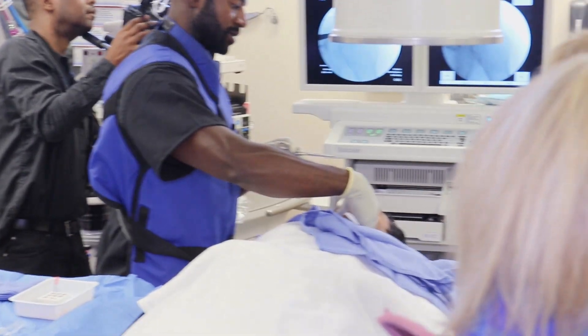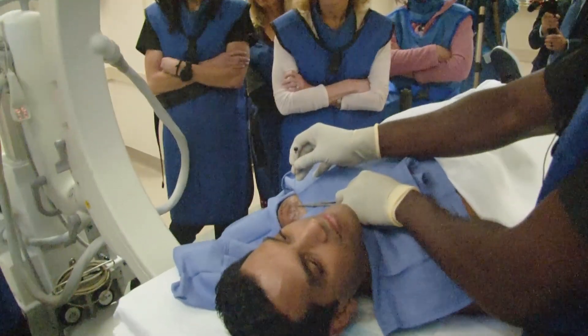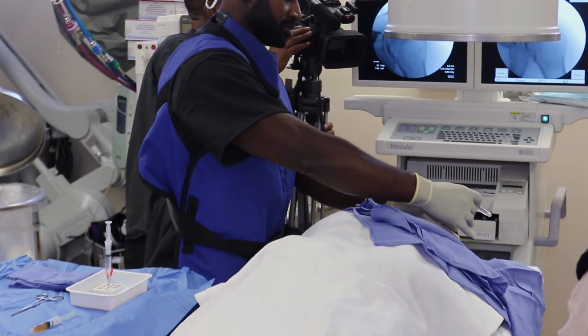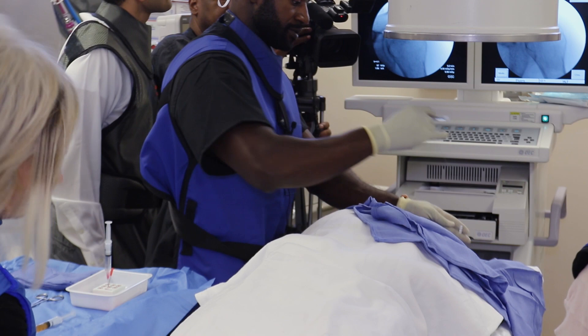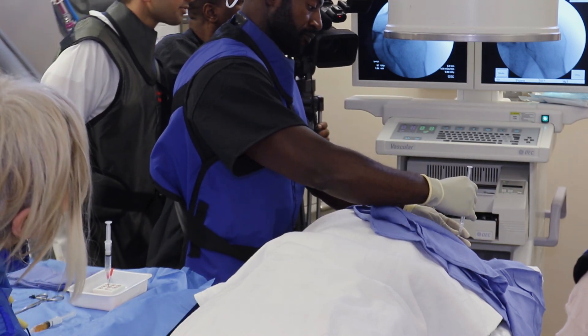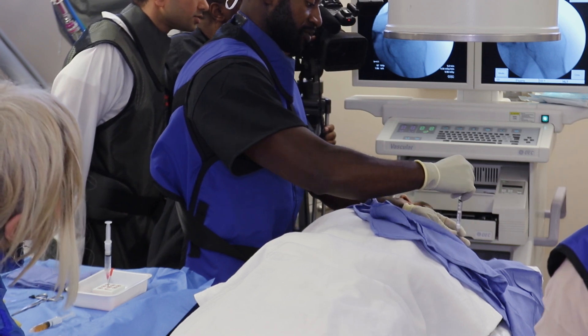And burn from in the middle. Alright, here we go. This shouldn't be too bad now. This is not comfortable — it's not one of the most comfortable joints to inject. And sometimes you have to adjust it depending on your contrast.